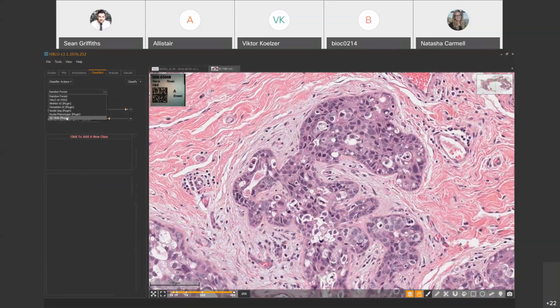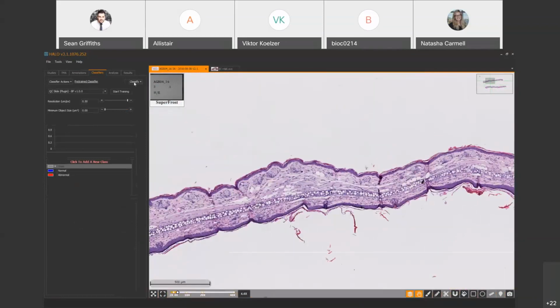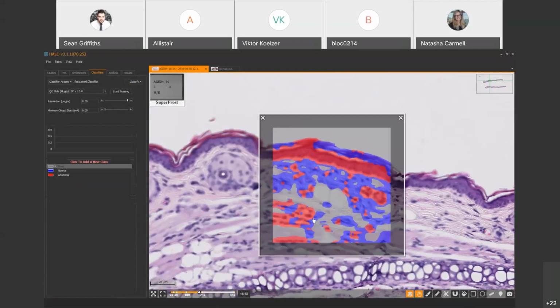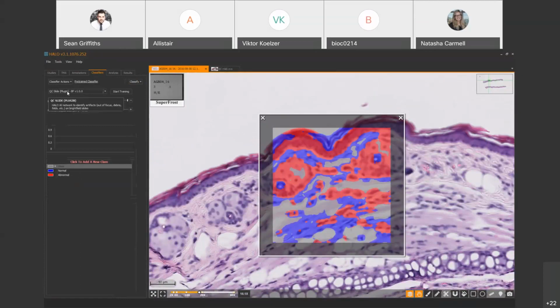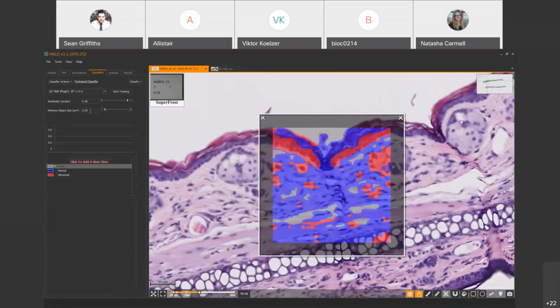There's another one here as well, the QC slide, which is again a pre-trained network that identifies areas that are blurry. I don't know whether it'll work here. There's a very light blur here, but if you start training, you should see the Halo try and find areas that are blurred or out of focus. It might need some additional input here, but that's another network that's going to ship with 3.1, the QC for slides. So if you were generating a large number of slides, then you could QC them quickly based on the area that's out of focus. Let's put a minimum object size in.